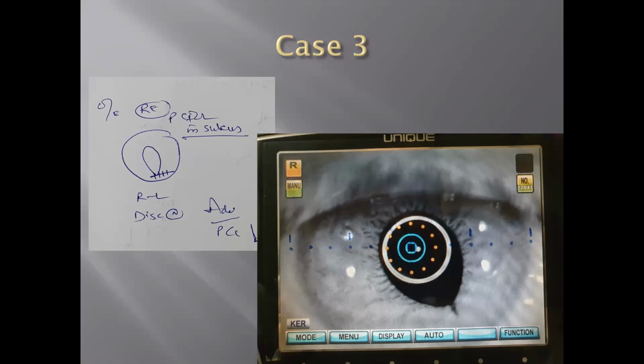So this was a big foreign body which has entered into the eye, and somebody has done surgery for corneal tear repair with foreign body removal about 4 months back. Now, after that, about 2 months back, I operated on this patient, and as there is a rupture of the anterior and posterior capsule, I could not implant the intraocular lens in the bag.